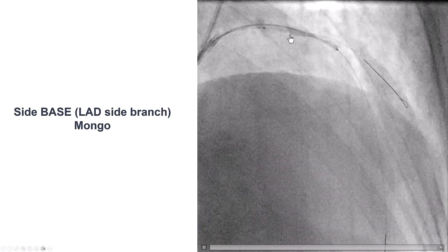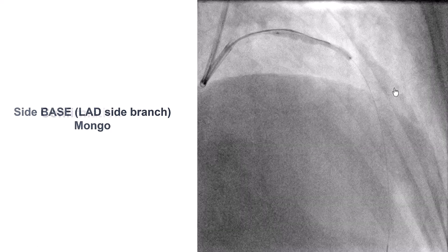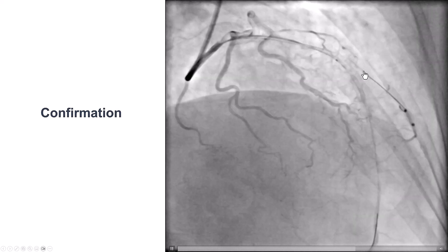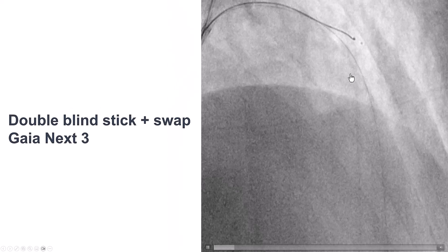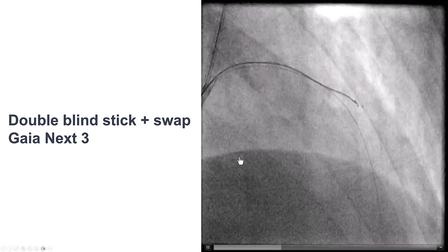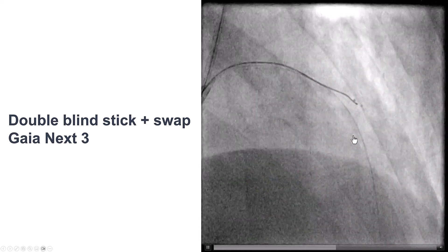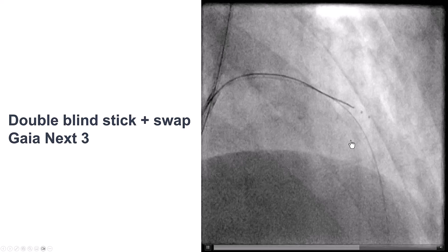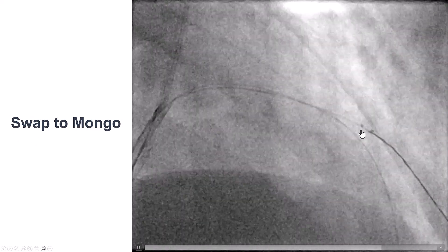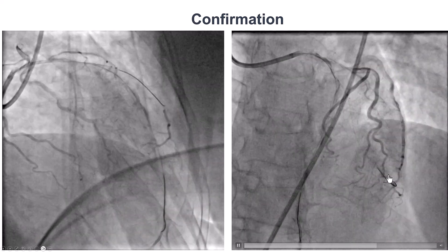We placed a balloon into the LAD and then wired. The wire seemed to separate from the LAD and advance along what appeared to be the course of the diagonal, which was confirmed with contrast injection. However, we were once again in the extra-plaque space. So we performed re-entry again using the same Stingray balloon — the Gaia X3 guidewire was directed proximal to the proximal marker, then redirected to re-enter between the two markers. We then switched to the Gladius Mongo, which advanced nicely, and with contrast injection confirmed crossing into the diagonal branch.